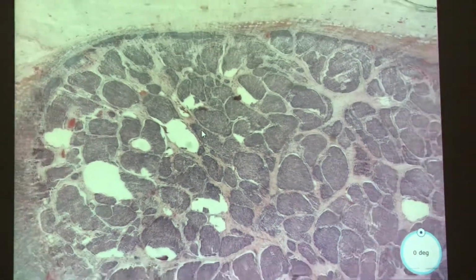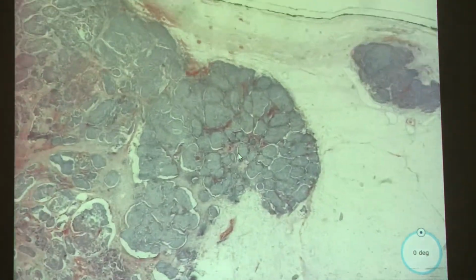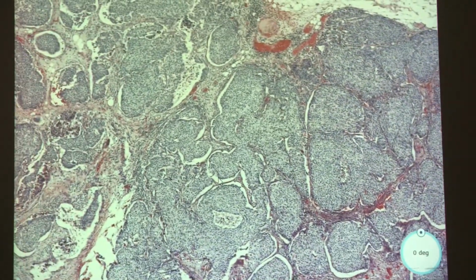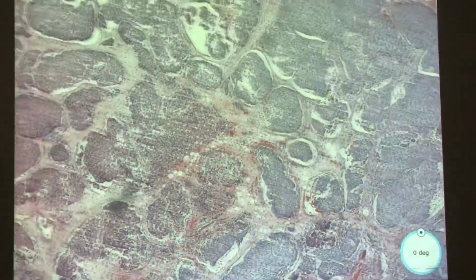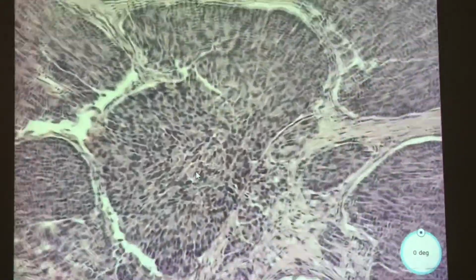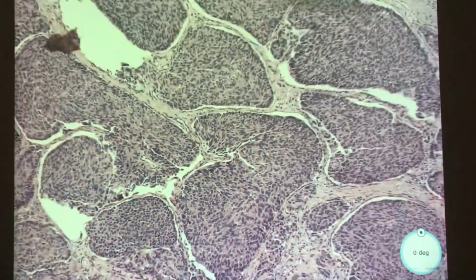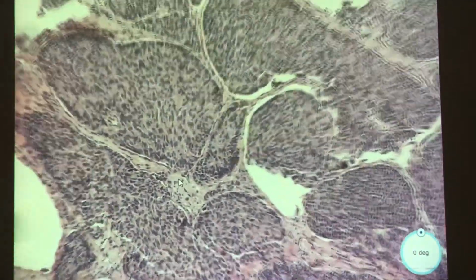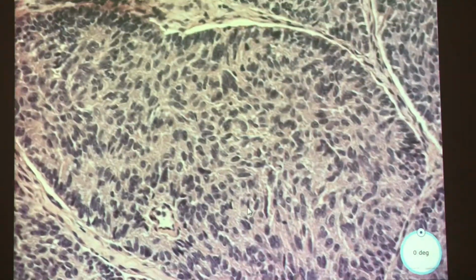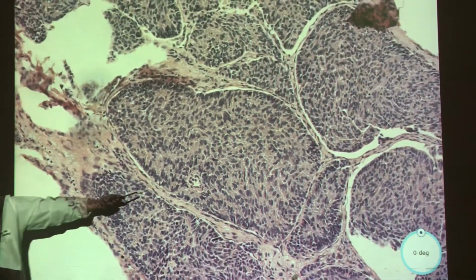Going in, it's almost like just these solid patterns sort of inside. So looking at these cells, these do not look healthy. It reminds me of something like a squamous cell carcinoma, like invasive squamous cell.